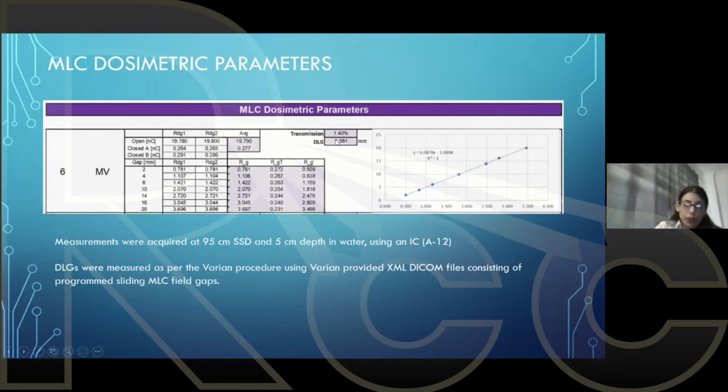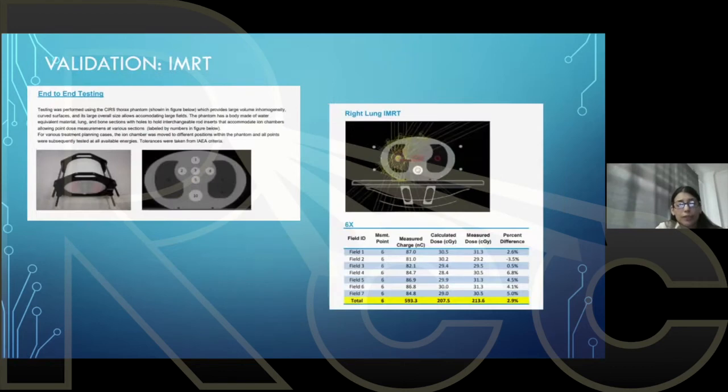So we went back to the treatment planning system, and you need to adjust this value. Sometimes your good start is your measurement, but then you calculate and you need to validate. If you are not satisfied with your results, you do an investigation. Where is field number 4 coming from? Is this what I expect?